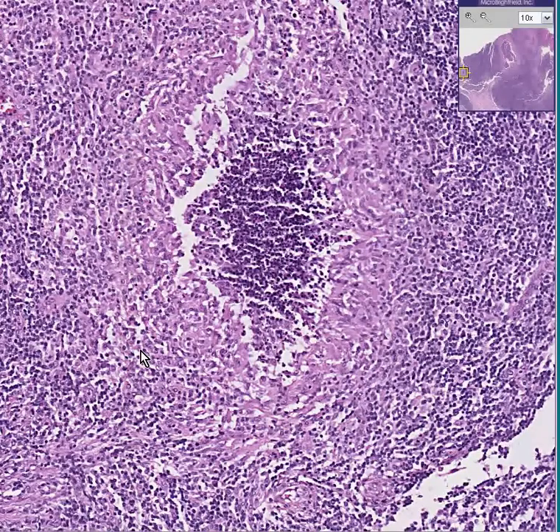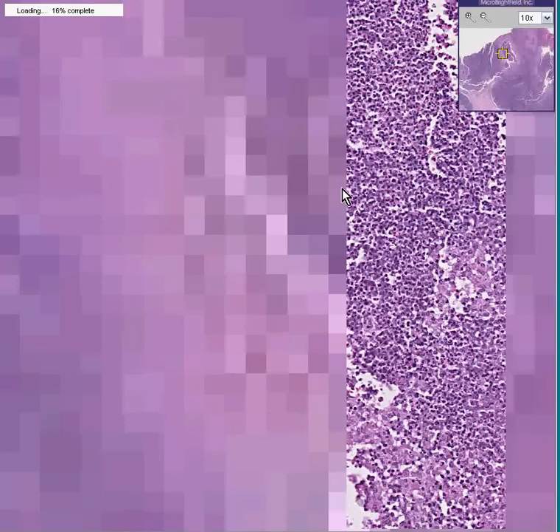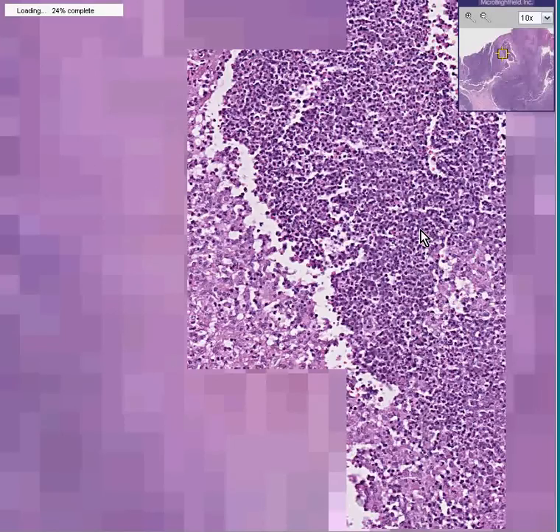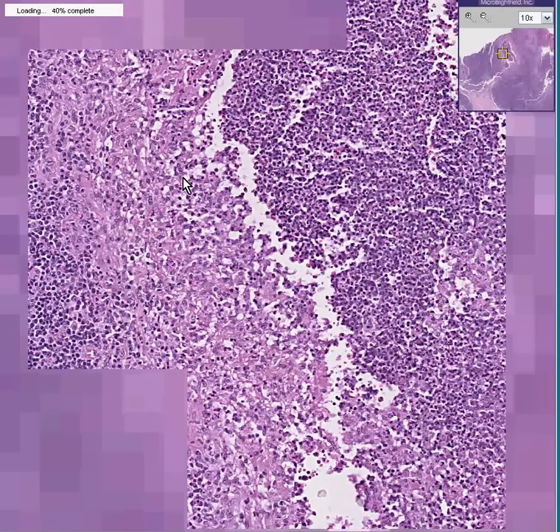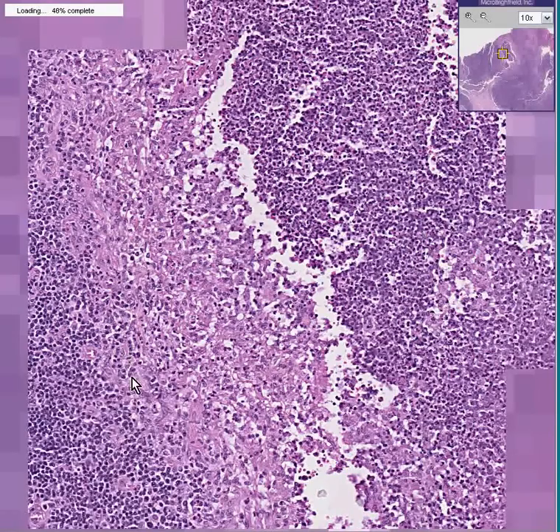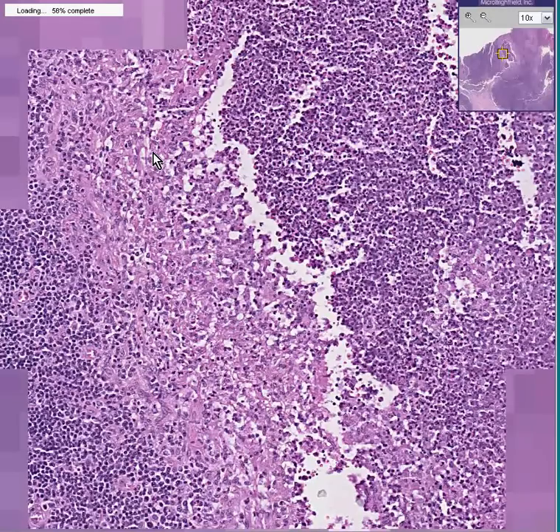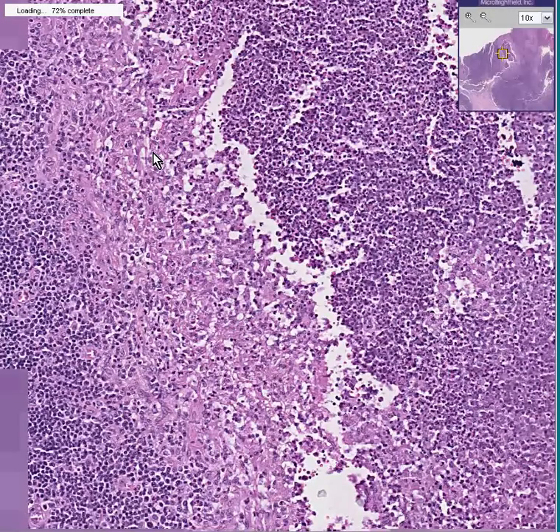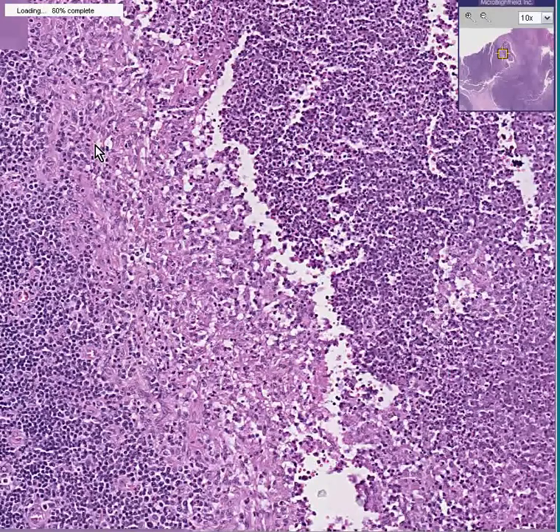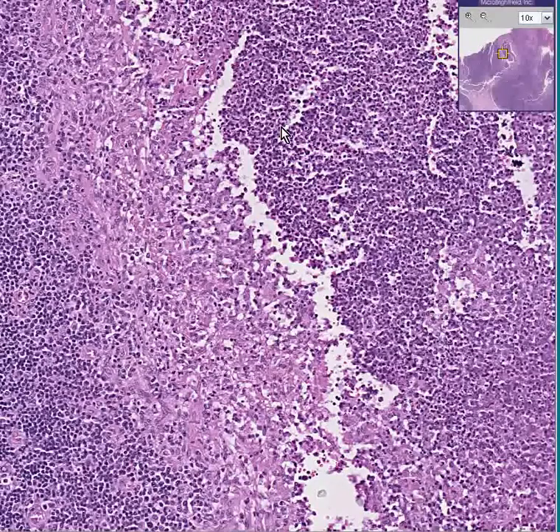Let's go to the other one as well. In the bigger granuloma, you can see chiefly granular, even partly necrotic perhaps, histiocytes as the primary cell of inflammation. You can see necrotic debris and neutrophils in the center, and you can see lymphocytes towards the outside.